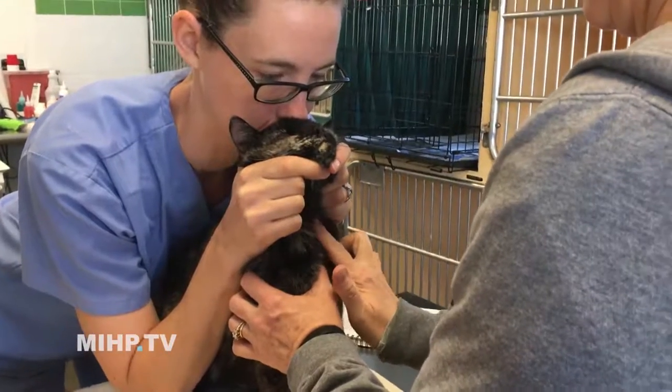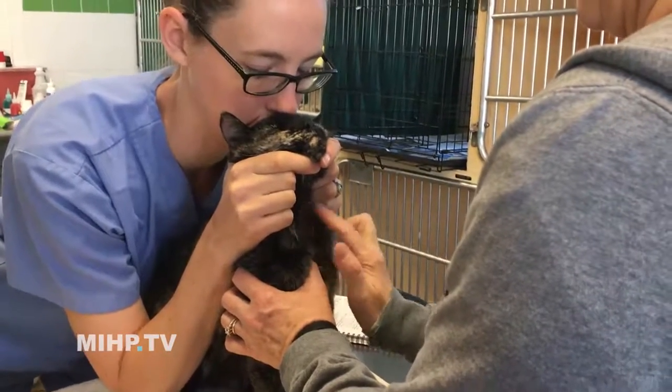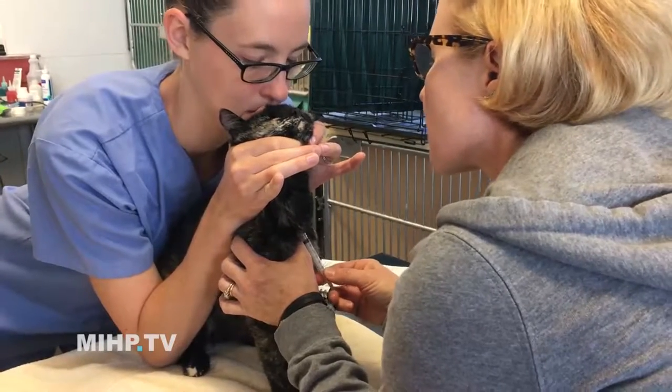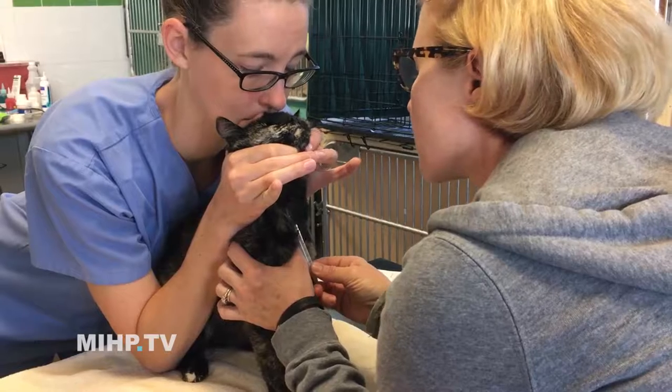They don't pass out, they don't hit their heads. They just sit there and go like, oh, okay, something's happening. So, where do we draw blood? On a dog and a cat, most of the time, we draw it from the neck, which is the jugular vein. These veins that run right here, the ones that stick out when you're lifting weights. In dogs and cats, that's probably the easiest way to draw blood. We just hold them in a nice, easy position, hold their head up a little bit, and then somebody else draws the blood. It's very simple.